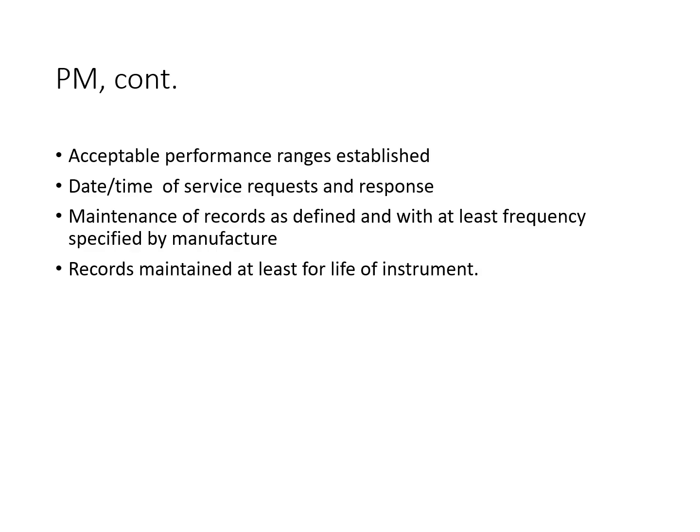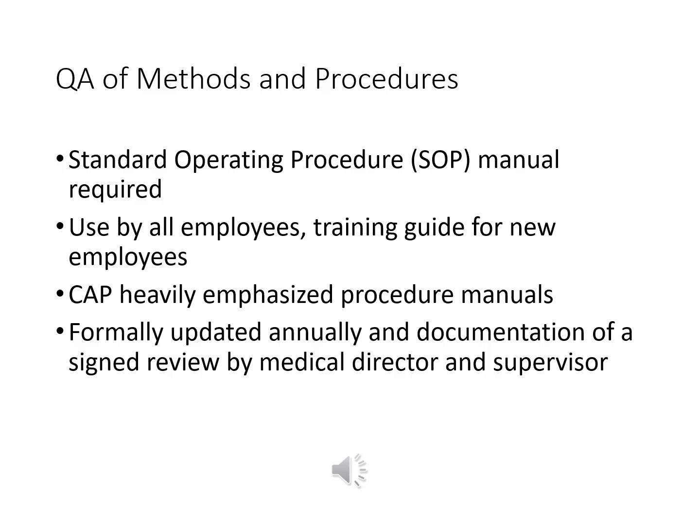Additionally, all records should be retained for at least the lifespan of the instrument to ensure traceability and compliance with quality assurance standards. Quality assurance of methods and procedures.